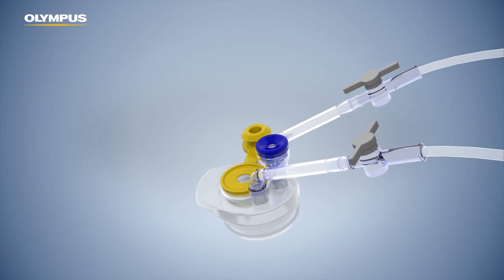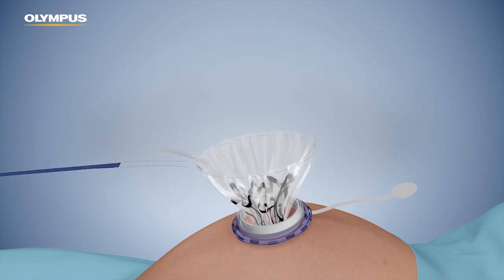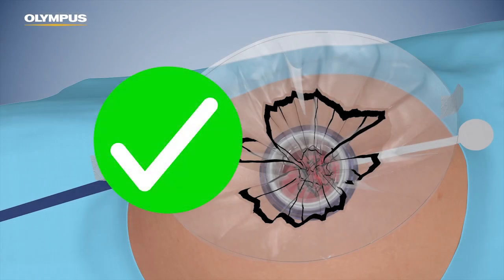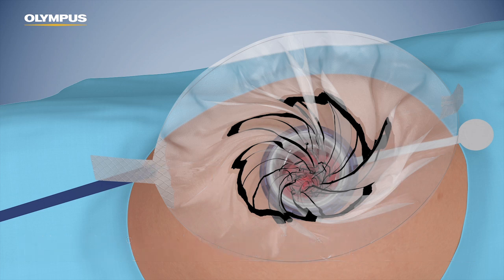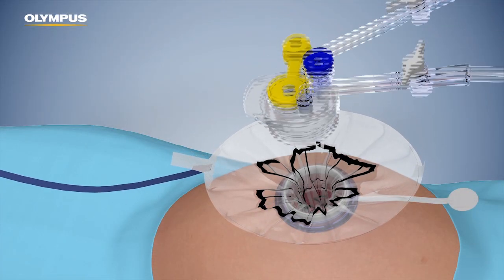Ensure that the boot remains in the sterile field. Pull the tether until the printed line is visible. Open the pneumo liner and ensure that it is in the correct orientation and is not twisted. A twisted pneumo liner can be corrected by pulling apart both tabs and carefully rotating them while slowly pulling on the pneumo liner. Reattach the boot in the desired orientation.